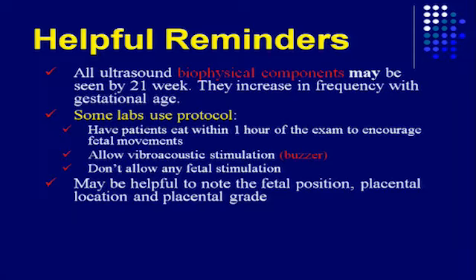But make sure you decide within your lab what you're going to do, and make sure you're looking at where the position is at. And remember, if there's a fetal anomaly, specifically a head anomaly, then that baby may not be doing some of those components. And usually the fetal breathing is the first to go if the baby's running into trouble.